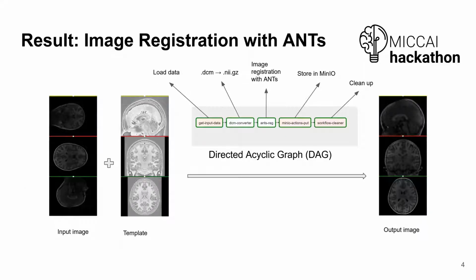One thing we did is image registration on brain MRI scans based on the ANTs toolbox. And this algorithm basically takes an input image and the template and registers the input image to the template. And the question was how to do that with Kaapana.